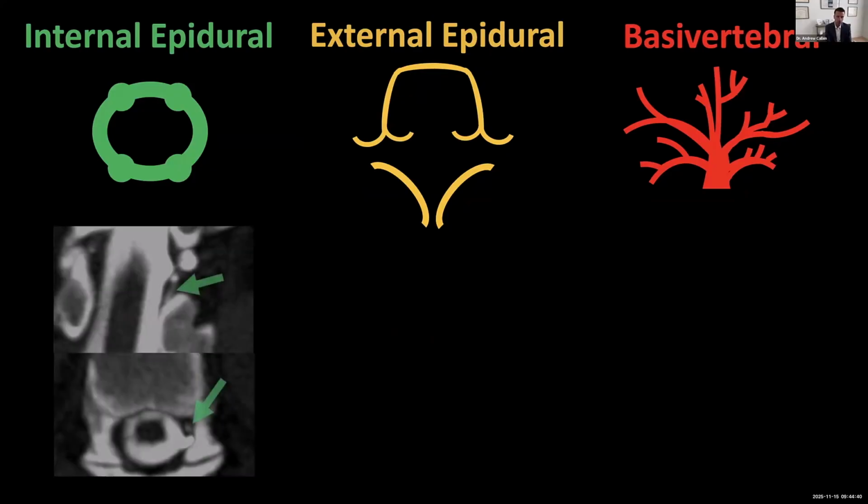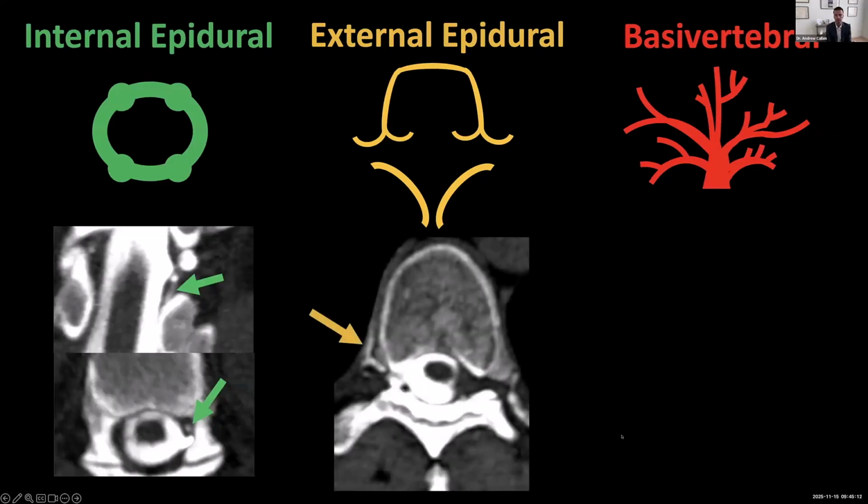So here's some examples of each of those. So here's some internal epidural CSF venous fistula. You can see on the axial image here, it just looks like a little dot. And if you're looking for a hyperdense paraspinal vein out here, you're not going to see anything. But instead, for all of my myelograms, I also like to look at the coronal view. This is the view where it's like we're face on to the patient, and we could see much more clearly that there is this linear vascular structure here arising from the inferior margin of this nerve root complex, going into that internal epidural venous plexus. But this has to be a part of your search pattern, just that little dot next to the dura.